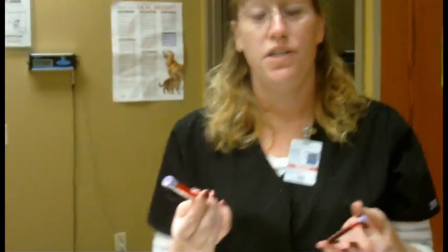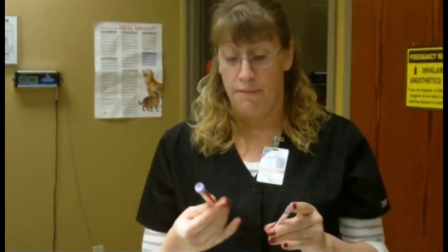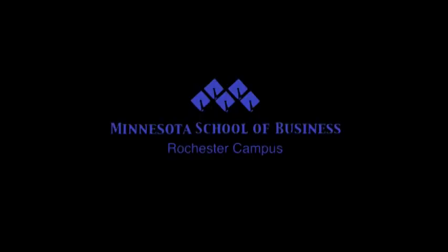So with these two tubes of blood we're going to do a CBC or white blood cell analysis on Marmaduke, the patient we just drew blood off of. This is going to tell us if he has any infections and how he's doing generally within the body.